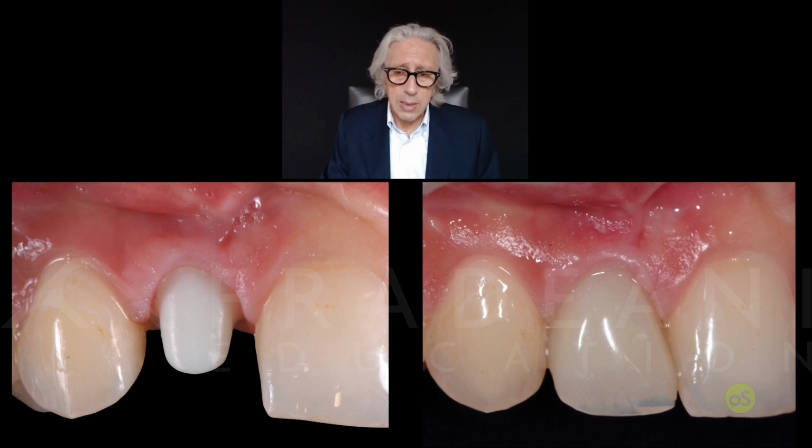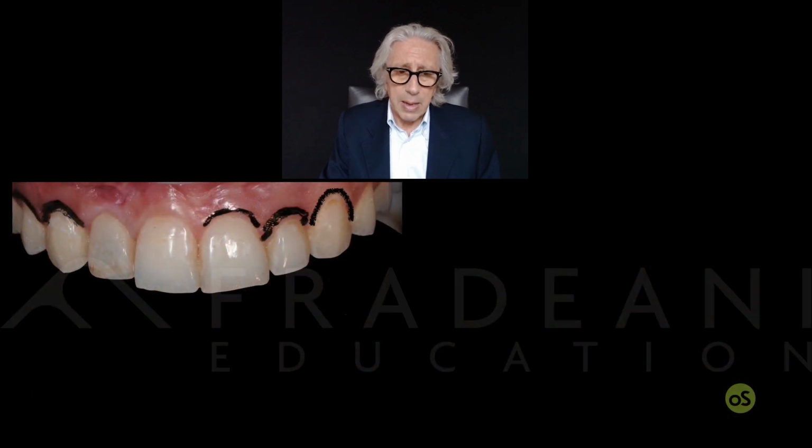The oral environment, you see that the papilla height seems to be quite nicely positioned, and also the gingival outline seems to be quite nice, integrated biologically. But still, we have not found a perfect result in terms of length of the incisors, on the cuspid and the laterals. With the black pencil we designed for our surgeon what we would like to have in terms of final outcome.